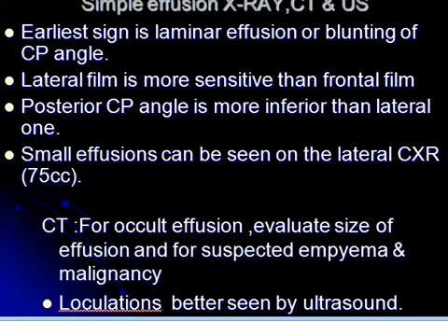of the effusion, and as we said, for suspected empyema, thickening and loculation, or suspected masses. Of course, loculations are better seen by ultrasound.